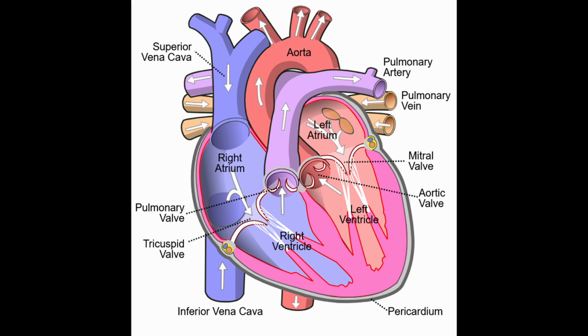When we refer to wedging, this is one of the fundamental benefits of using a catheter like this. Typically, when a catheter is in a chamber, the distal port of the catheter is measuring the pressure in that chamber. This is still true for the wedge catheter for any chamber that is larger than the balloon. So all the way from the right atrium to the main pulmonary trunk, you're getting the pressure as measured in any of those chambers. Once the balloon wedges, this means that the balloon presses into a certain vessel and the balloon is occlusive around the wall of the vessel.